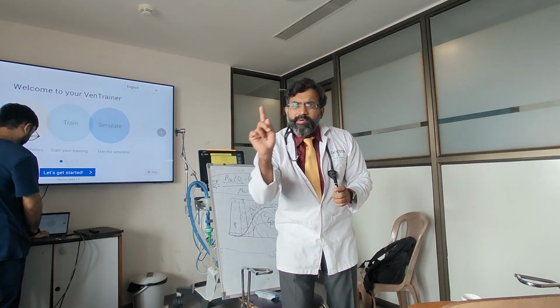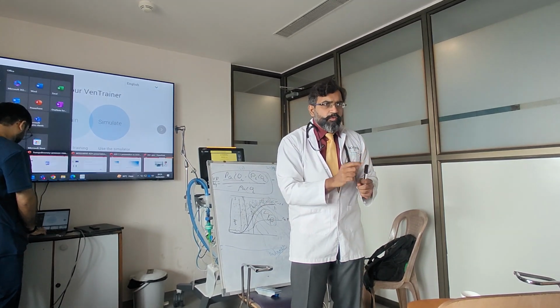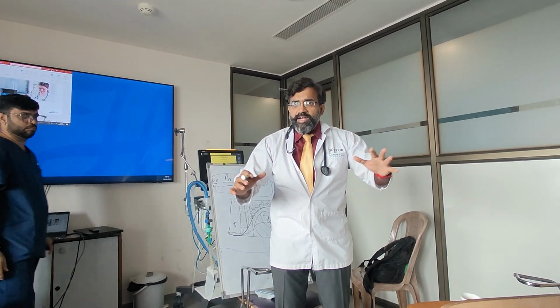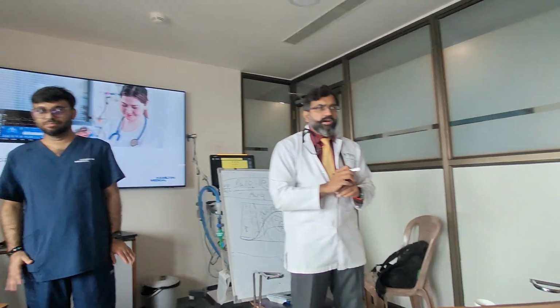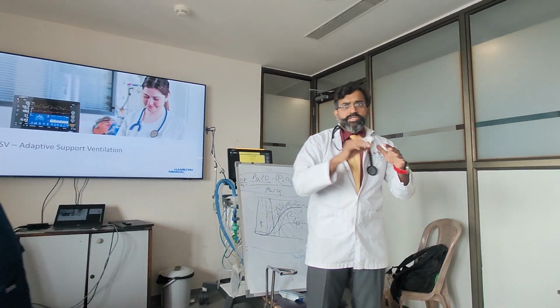But these are only one parameter each. If you notice what I'm talking about, it is one parameter that they are changing. So if you want to put all of these together in such a way that everything is taken care of: when I said SmartCare, only ETCO2. When I take pressure control, only pressure. When I take pressure regulated volume control, pressure and volume.